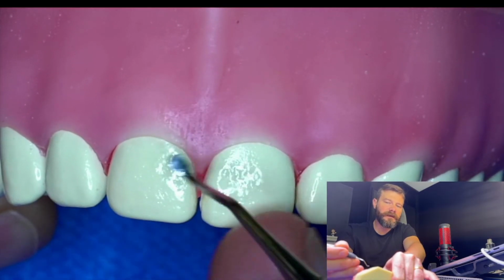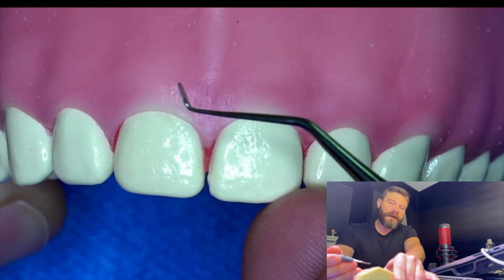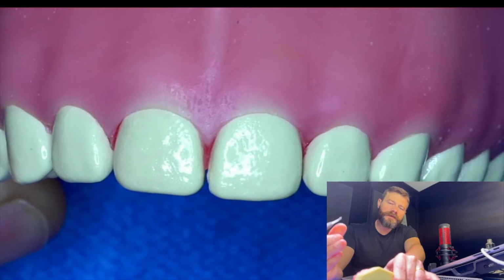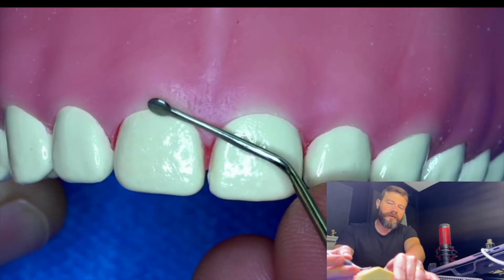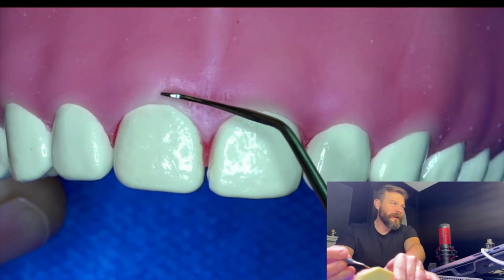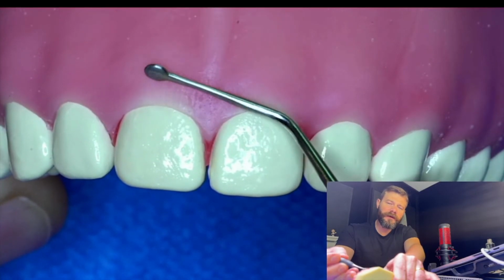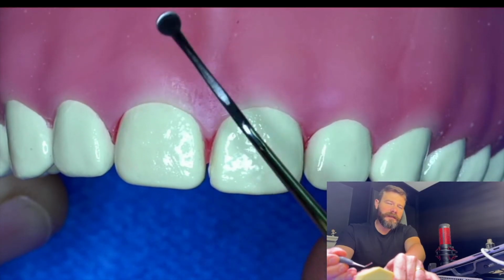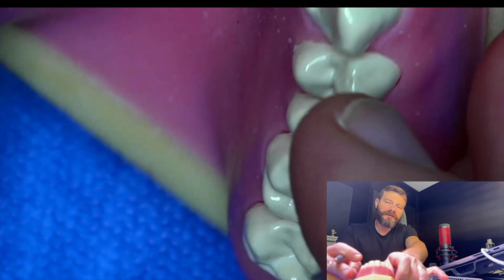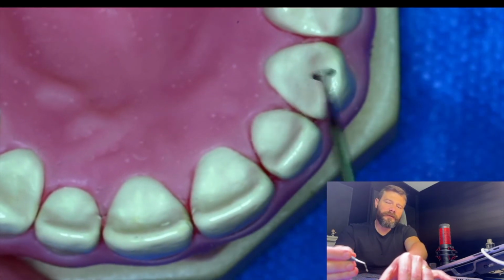Okay, very delicate way. You have in this instrument one side, one tip exactly with this shape, and in the opposite side you have once again like a regular tunneling instrument. Ricardo, why do you have this tip here on your instrument? This tip was designed when you need to do a tunneling on the lingual side, especially on the lowers.